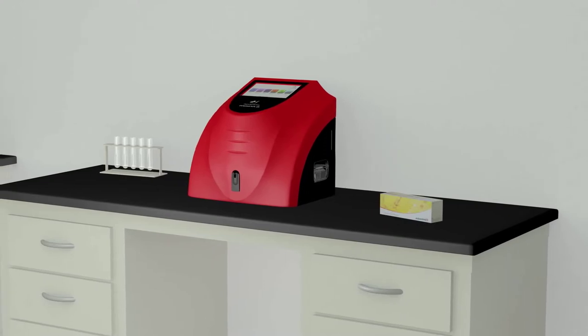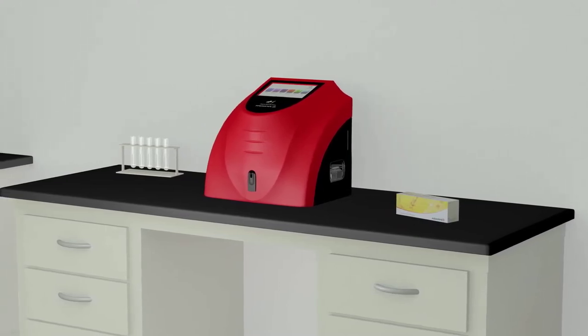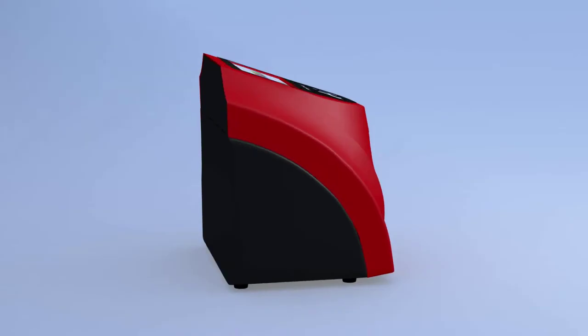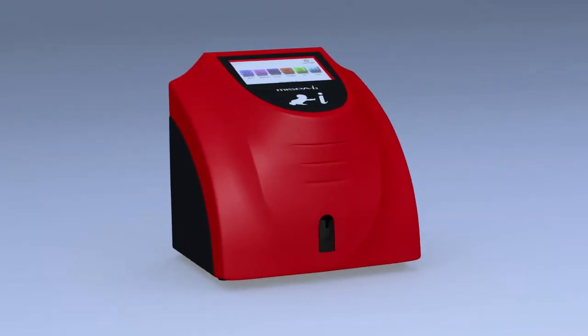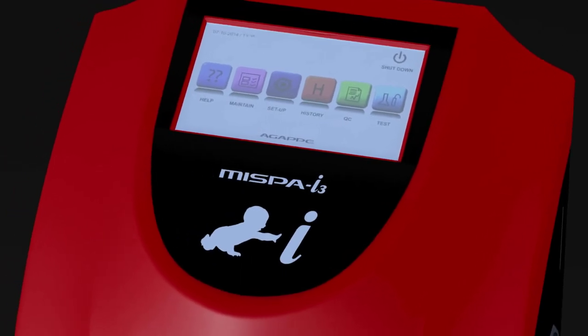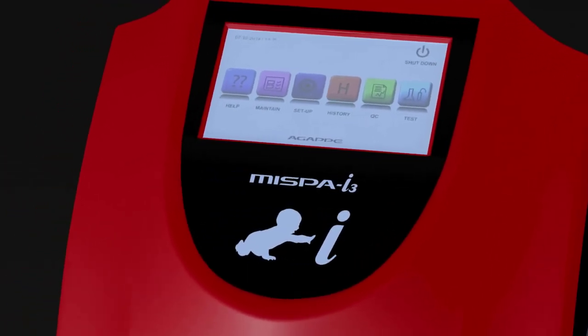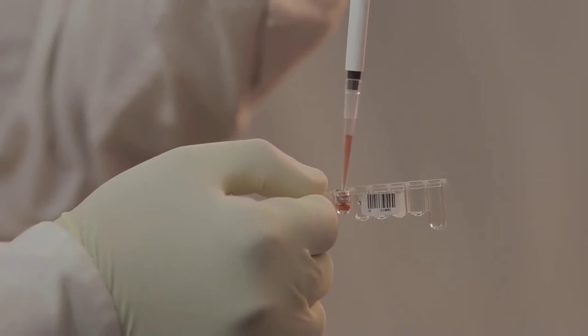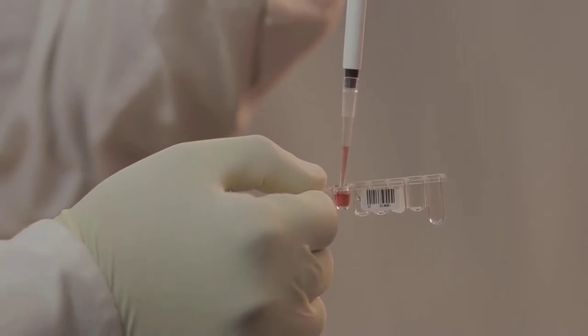With its small footprint and no hidden compressor, MISPA I3 can be placed on a small bench in the lab. The analyzer is very user friendly with simple step-by-step instructions displayed on a bright backlit screen. The sample is loaded on a specially designed cartridge that uses only a few microlitres of sample.